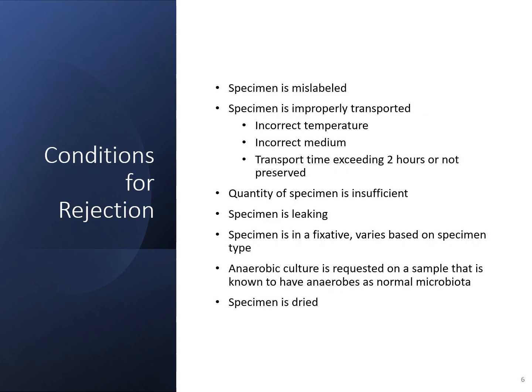There are situations in which specimens would be rejected, although with micro, it is a little harder to recollect specimens. When specimens need to be rejected, that's something that may need to be discussed with the physician or the pathologist of the lab to determine if you should proceed with that specimen.